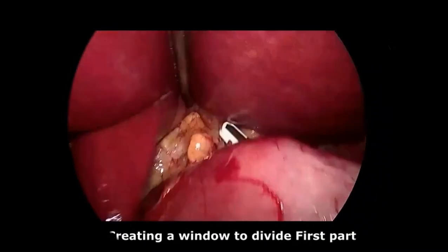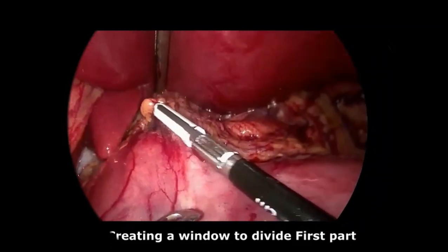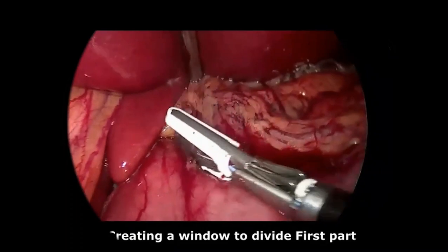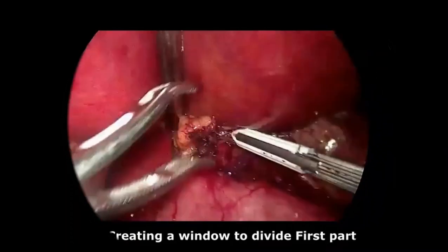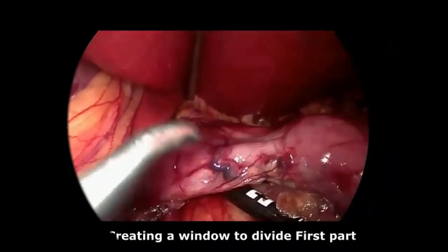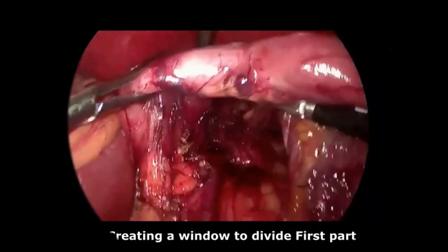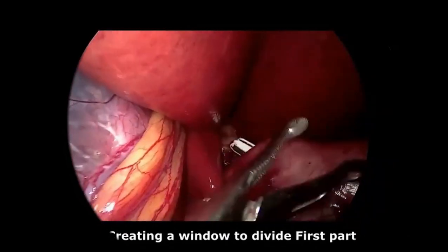Creating this window is very important so that I can pass the stapler. I can coagulate some peritoneal attachments so that I can get the window larger for easy passage of the tape and later on the stapler. I have very nice length, as you see, of the duodenal stump.